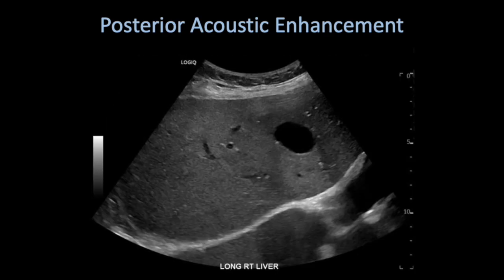Going back to our original example, we have a cyst within the liver with posterior acoustic enhancement caused by less attenuation of the sound beam.